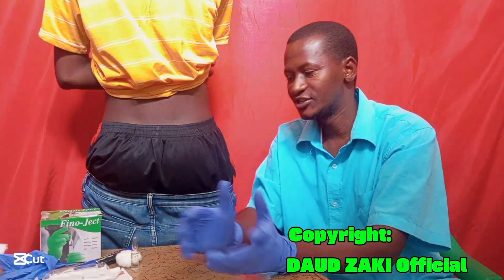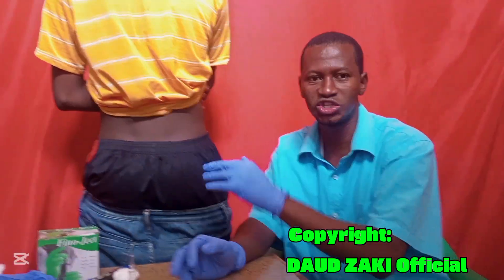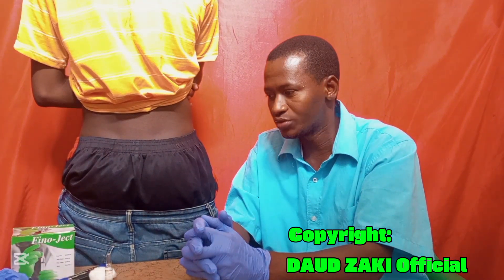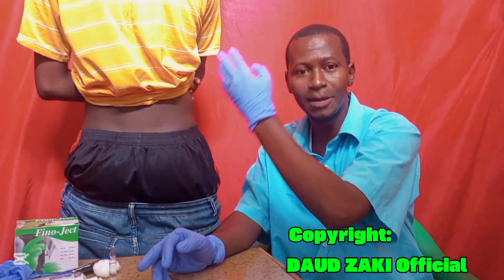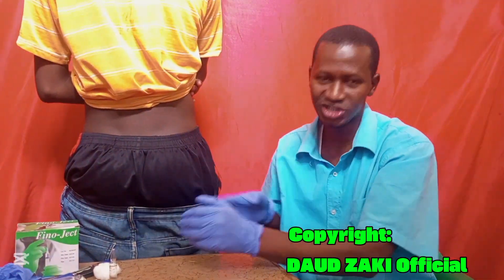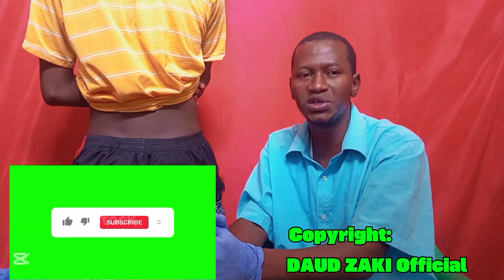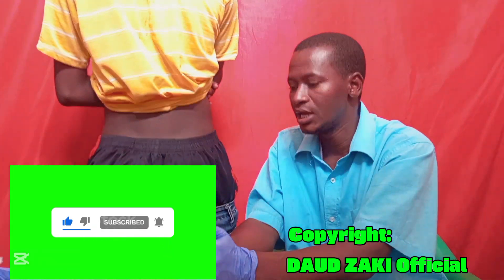Welcome back. In this tutorial I want to show you how to perform an IM injection, especially in the gluteal muscle. There are three different areas where we administer intramuscular injection: the deltoid muscle (upper shoulder), the ventral gluteal muscle (around the back and hip), and the vastus lateralis (around the thigh region).